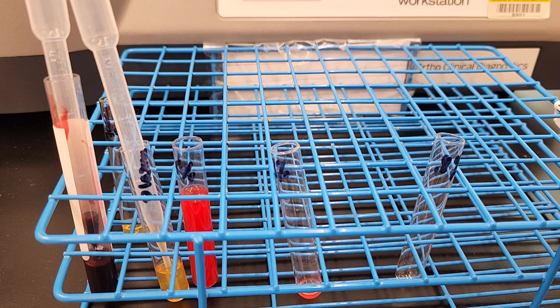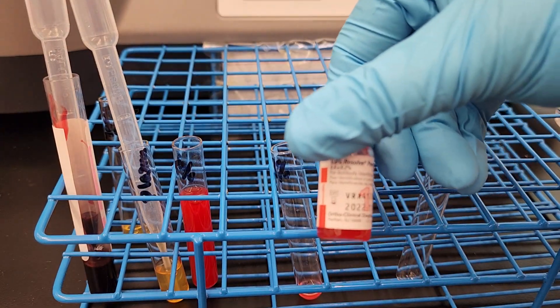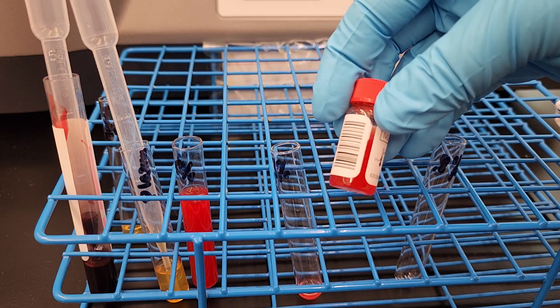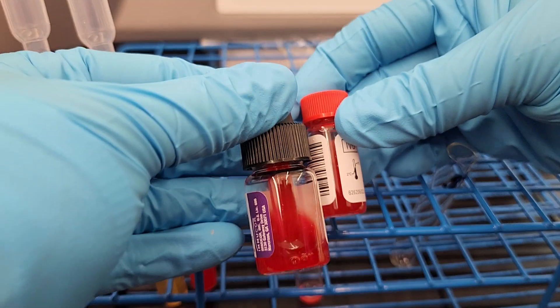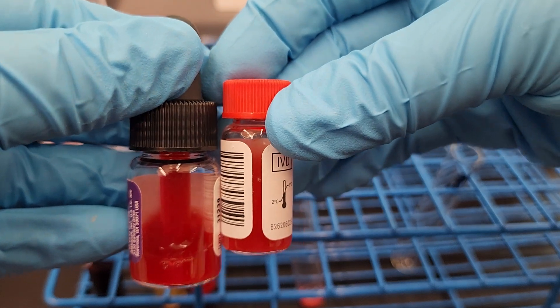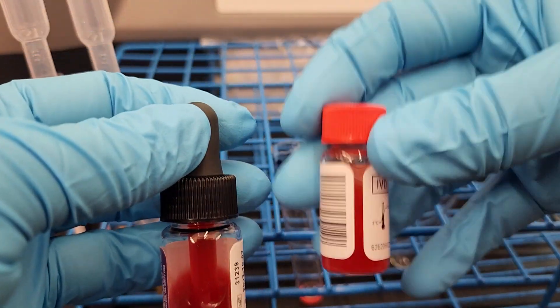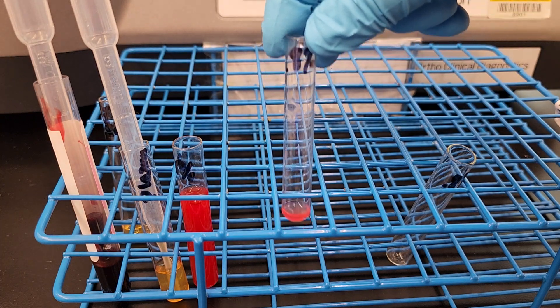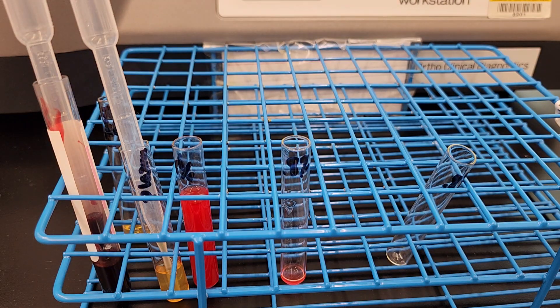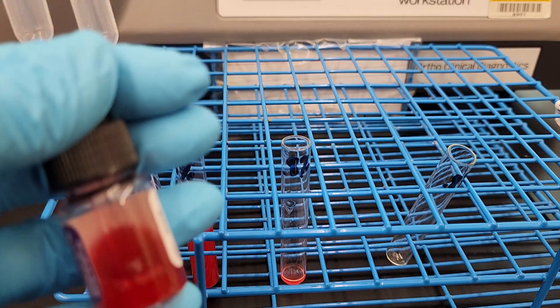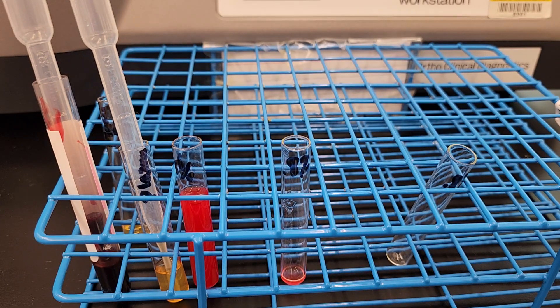And if we look at the reagents, you can see the difference in those as well. So this is for gel, and that's the 0.8%, and this is the tube, and that's the 3% to 5%. So you can see, I think the camera's picking it up pretty good, but this is lighter than this one. So when you put this into a gel or your 0.8% in your auto control, you'll see that it looks extremely light, and you're thinking, oh, my gosh, something's wrong. It doesn't look as dark as the tube does. I'll show you what a 3% to 5% cell suspension looks like in gel, and you'll see why we don't use it.